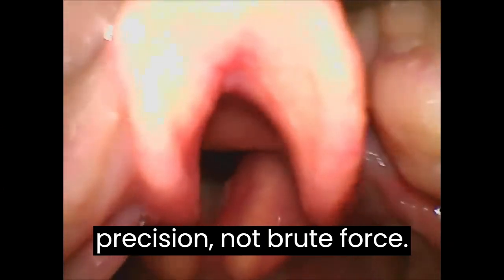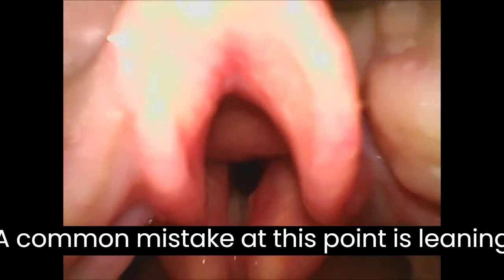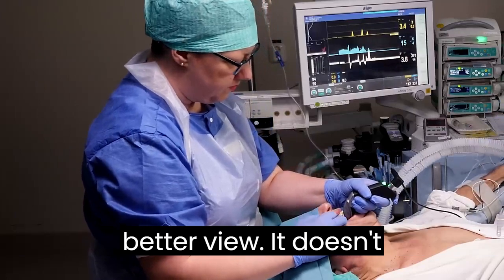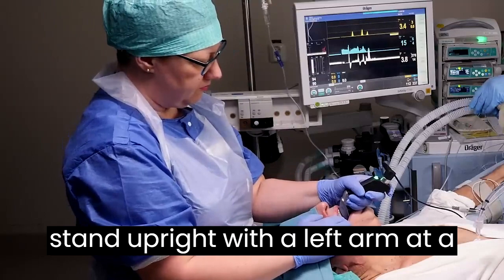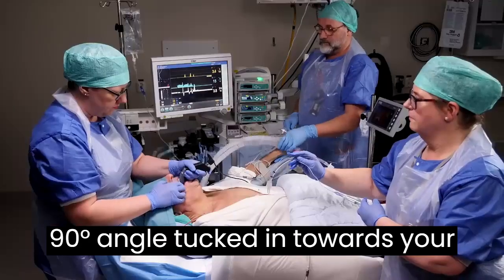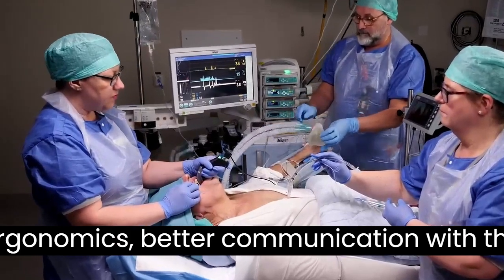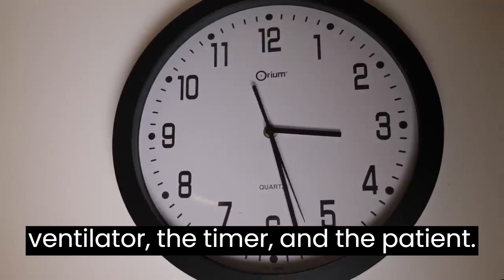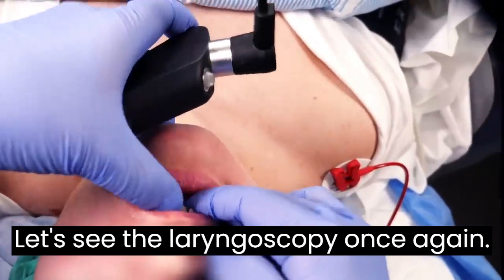This requires precision, not brute force. A common mistake at this point is leaning forward, as it feels this will give a better view. It doesn't. Stand upright with the left arm at a 90-degree angle tucked in towards your body. This allows for better ergonomics, better communication with the team, and a better overview of the ventilator, the timer, and the patient. Let's see the laryngoscopy once again.